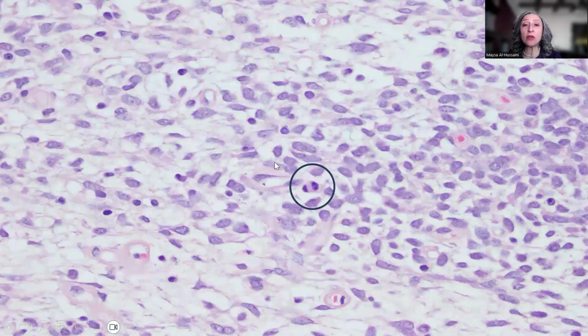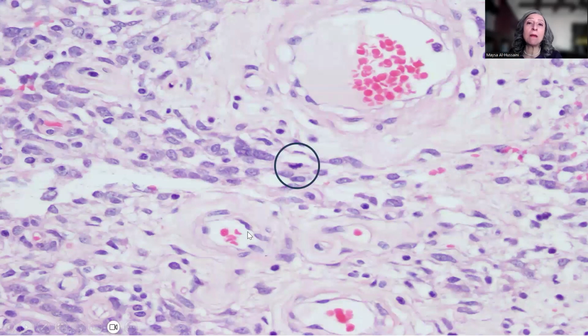of solitary fibrous tumor. Now, again, some hypercellular areas, some hypocellular areas with myxoidish background, but then we started to see mitosis, mitotic activity. And counting mitotic figures, there were almost 4 mitoses per 10 high power fields in the most active areas that were encountered. So this is another mitotic figure.